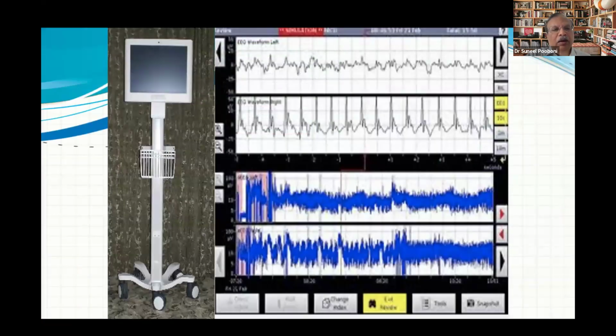Can be done on site in the ICU, and this is cerebral function monitoring, which we tend to use a lot on neonates on ECMO. This is a bedside tool. And the leads are limited to 4 or 6 in the CFM, cerebral function monitoring, unlike EEG, which has got 12 to 18 electrodes.